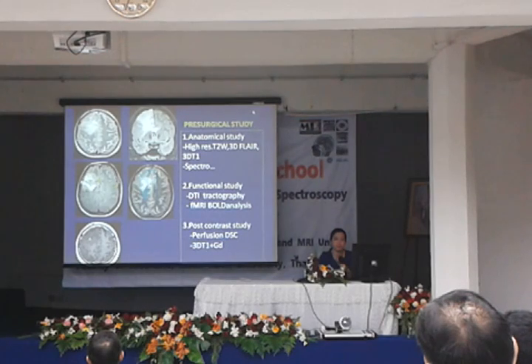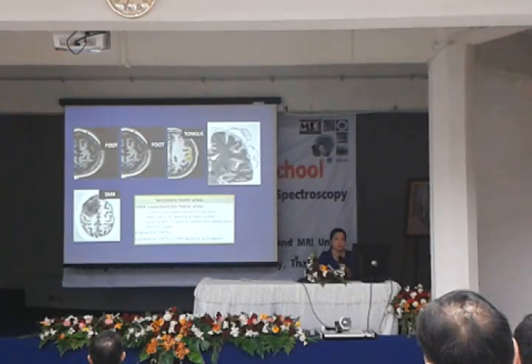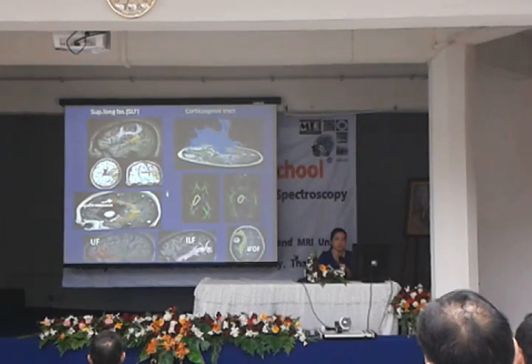And right now the pre-surgical study has to run not only conventional images, but also functional MRI and DTI. Then the technologists or radiologists who do the functional MRI have to know how many fiber tracts are in the brain and how to draw the lines to connect this anatomy in the correct location and correlate with the region.